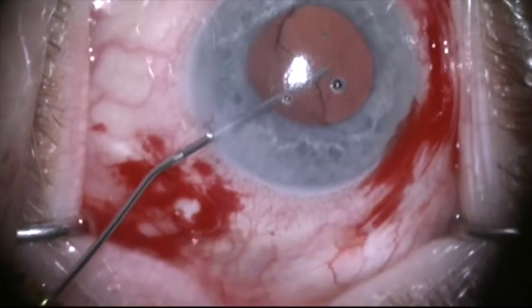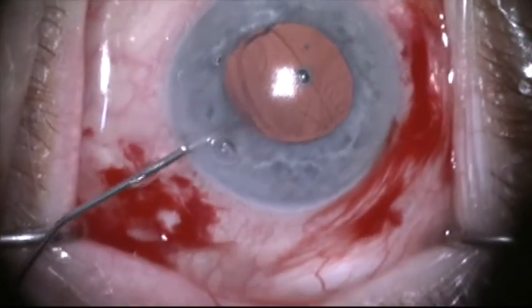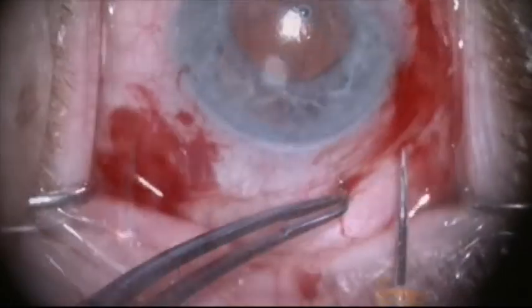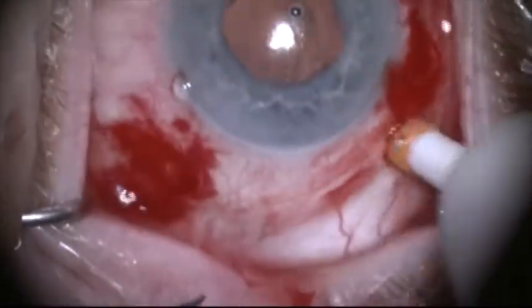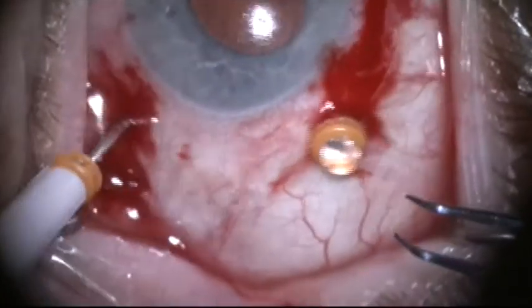Here I've made two paracenteses and injected dispersive viscoelastic into the anterior chamber to protect the cornea. I'm placing pars plana trocars three and a half millimeters posterior to the limbus.